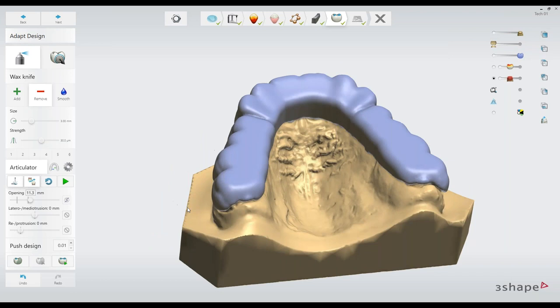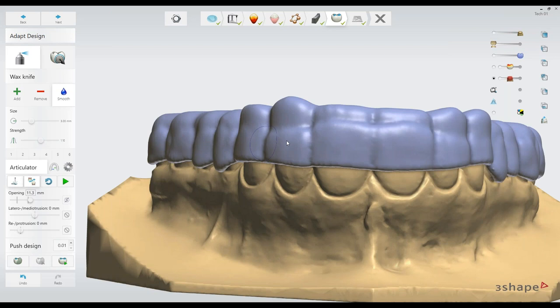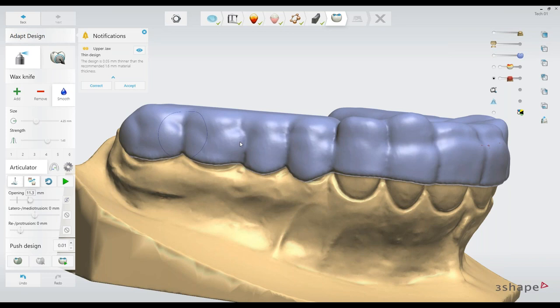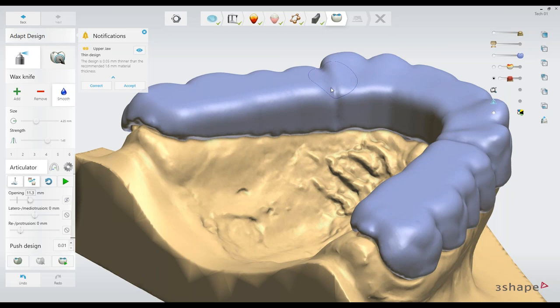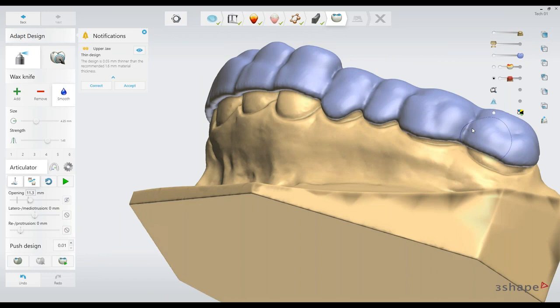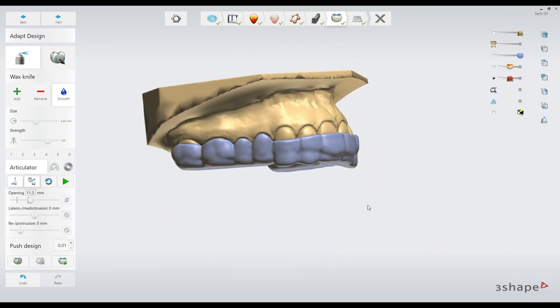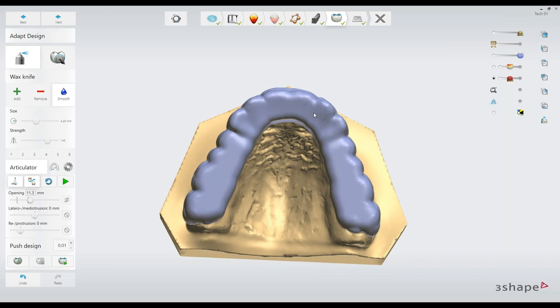Now there are no thin spots. I can come in and use our smooth tool — enlarge it and turn on a little bit of the strength — and just come through and smooth things out. Maybe some transitional areas need to be a little bit smoother. For the most part it's really nice — it's fast, user-friendly, and the workflow, user interface, and icons are pretty much what everyone's used to day-to-day using Dental Systems tools and workflows. We're pretty much wrapped up with Splint Studio.